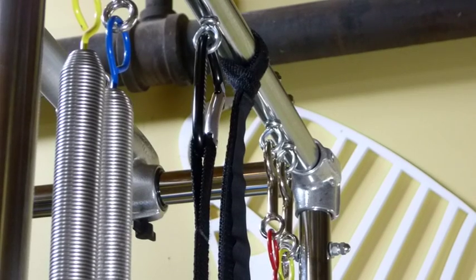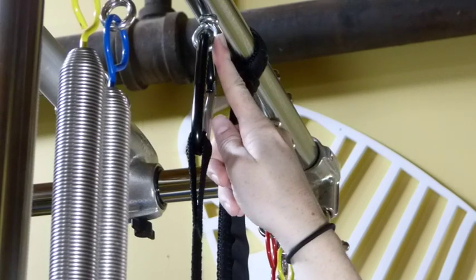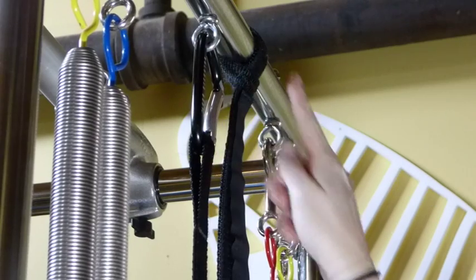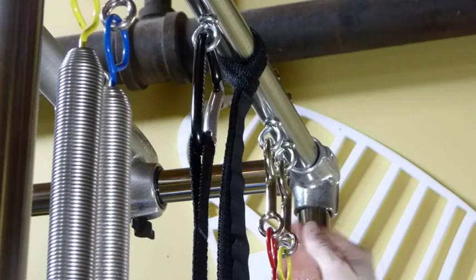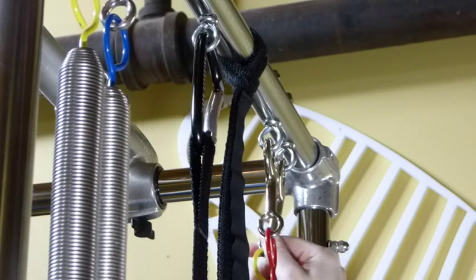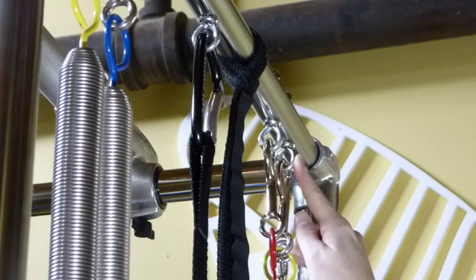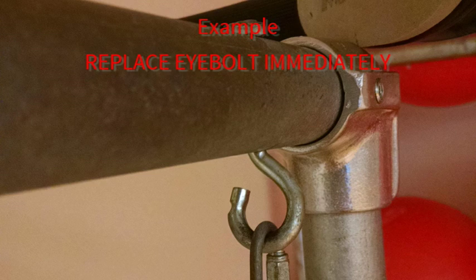Another safety issue that we want to watch out for happens especially up here on the horizontal crossbars of your canopy. We want to look at these eye bolts and make sure that none of them are bending open to where the spring dog clip can just pop out without depressing the spring. These ones all look great, but I'll show you a picture of one that is opening up that you want to avoid. If you see it opening up, be sure to change it right away.